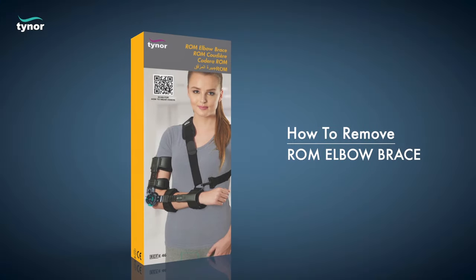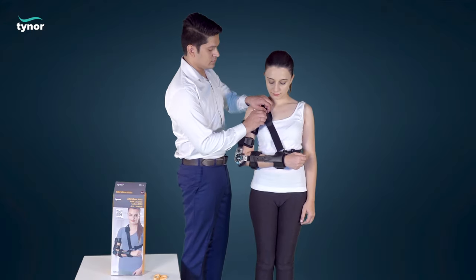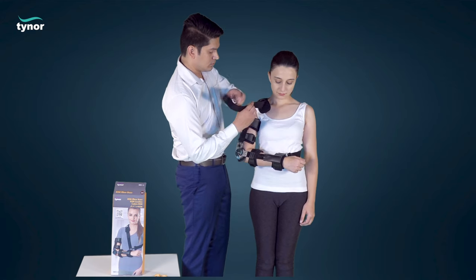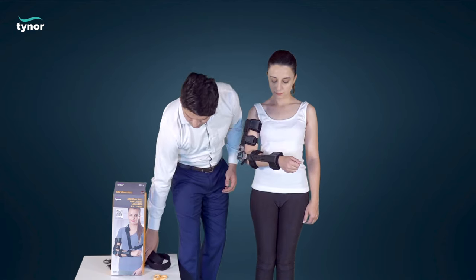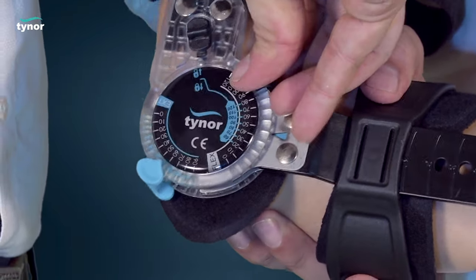Now let us see how to remove the ROM elbow brace. Unfasten all the straps and loosen them to remove it safely.